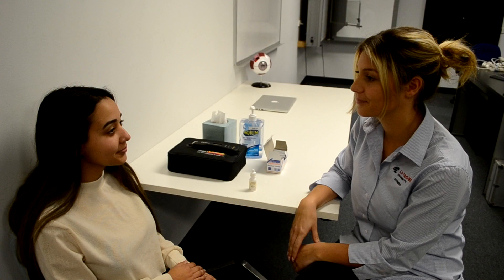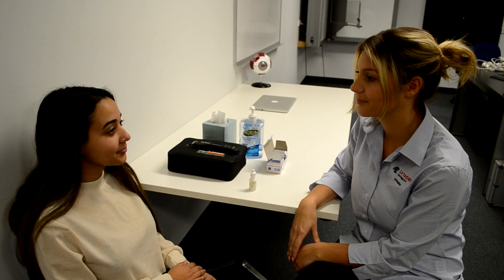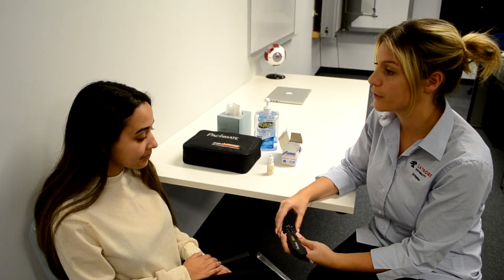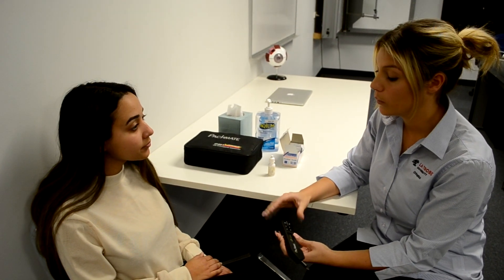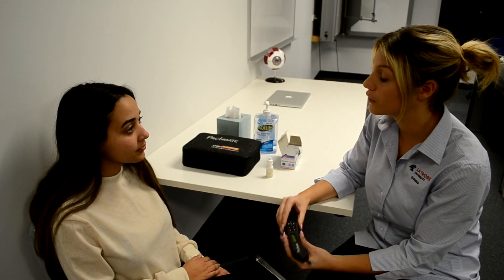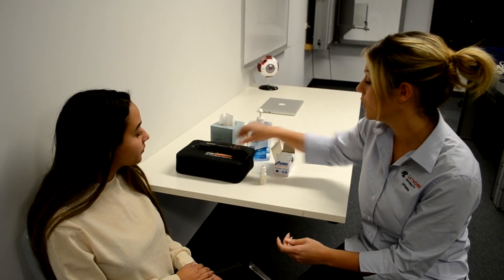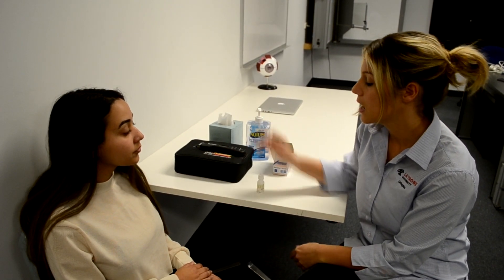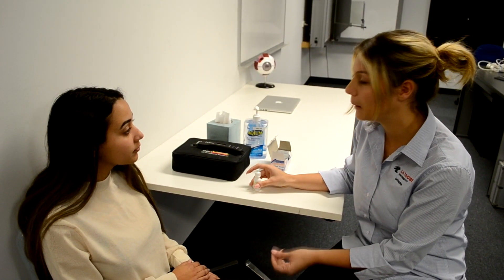It is important to inform the patient what it is you will be performing and why this is important. Reassure them that the assessment will not be painful. "Hi, my name is Georgia. I will be your student orthoptist for today. We're going to be doing a pachymetry test with this instrument here. It's going to measure the front surface of your eye, which is your cornea. When we get this reading, we'll be using it for another test that measures your eye pressure, and the information will help us interpret those results further. We're going to be using these drops to numb your eye so it won't hurt when we use the instrument — they will sting a little bit."